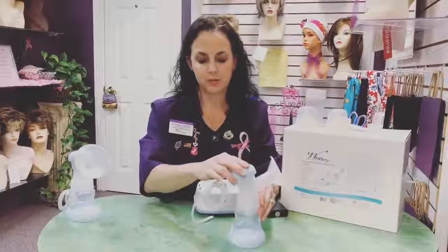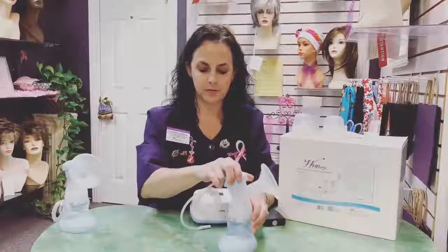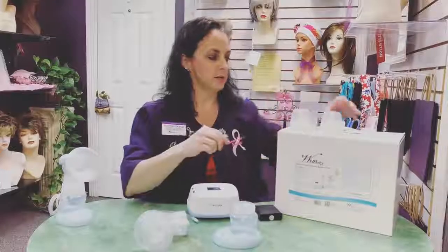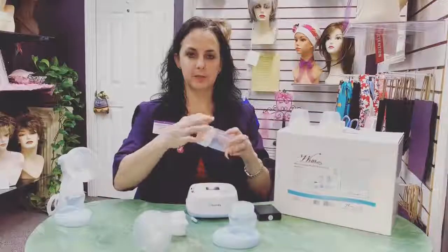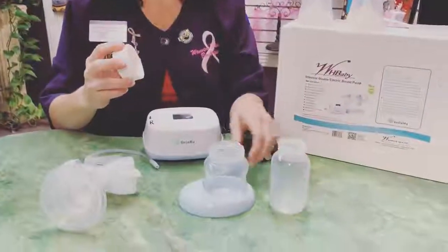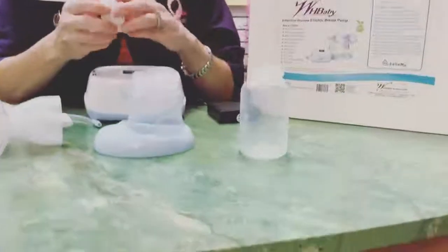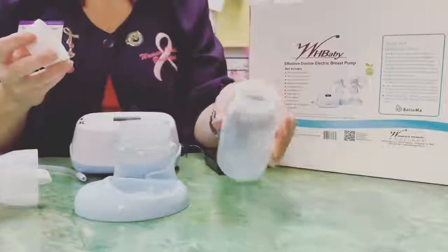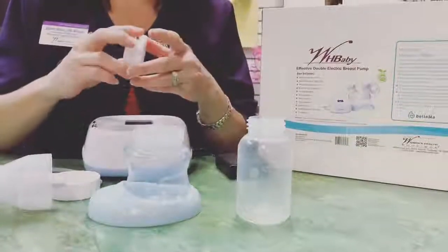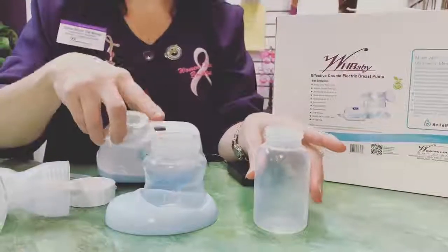Now, we want to make sure that you understand a couple other benefits of your pump. If you're using the wide neck bottles and you need to use your small neck bottles, because everybody's friends like to tell you how to use different bottles, this one happens to be a Medela or a Lansinoh. So any of the small neck bottles, except for the Tommee Tippee, they have one that's a little odd size. It's a little bigger than this and a little smaller than the wide neck.